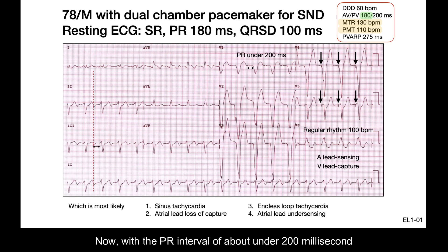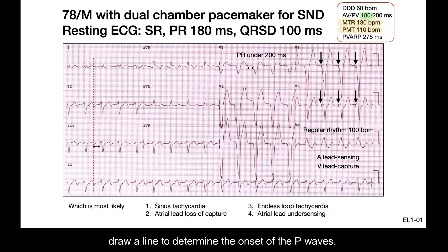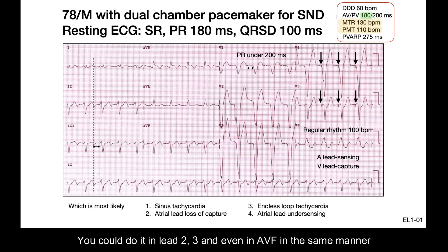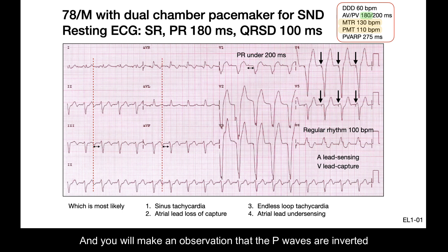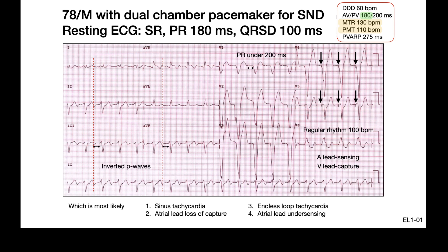With a PR interval of under 200 milliseconds, you could look at the inferior leads and draw a line to determine the onset of the P waves — in lead II, III, and even AVF — and you will observe that the P waves are inverted.